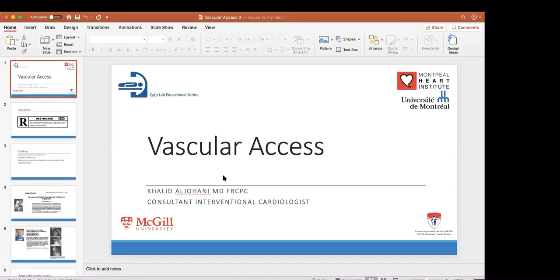Why the headache? Just do Judkins left, Judkins right, and اشتري دماغك على قولتهم. I think it's better to use the Judkins. However, if you're comfortable with a technique, use it as long as it's safe and you follow the rules. And even if the Judkins right got into the left main, coaxial, and a good grip, do the injection.